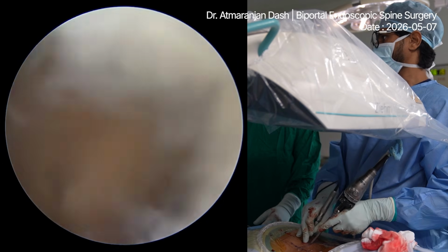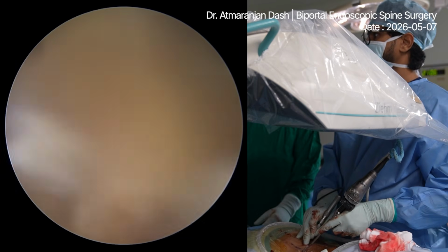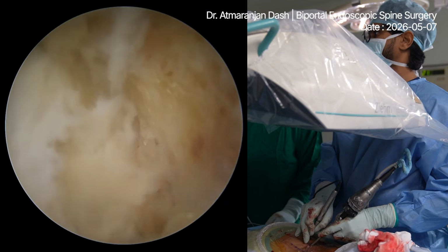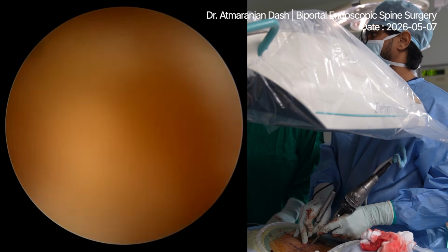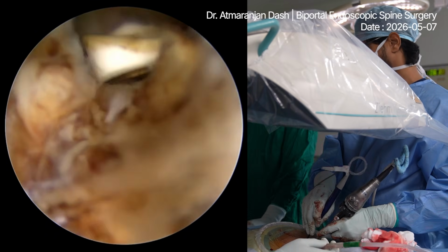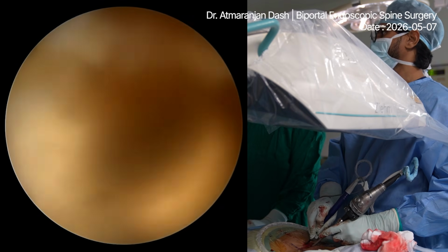See, the bone drilling is very important in these cases. So I am drilling the superior articular process, and this is the foraminal ligament. Without this drilling work, it is not possible to open up the foramen, especially at L5S1 level. Sometimes oozing does happen. Do not worry about this. RF plasma is a much better coagulation device, and in saline it is very easy.